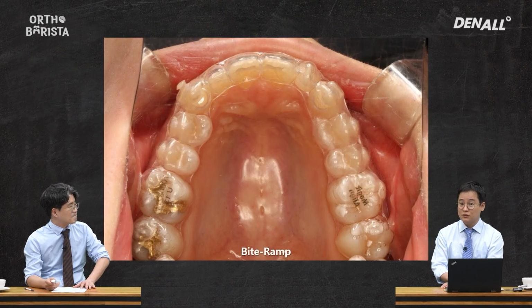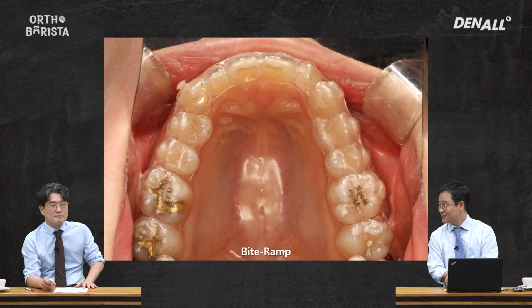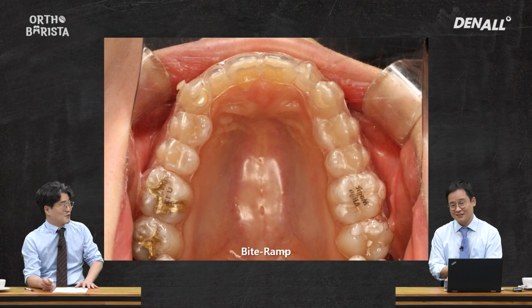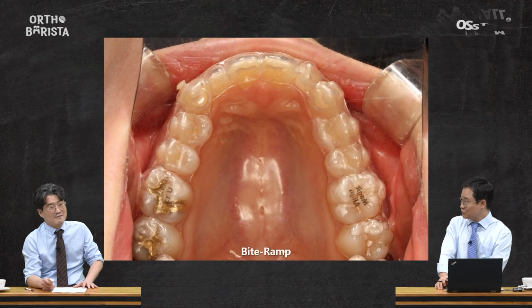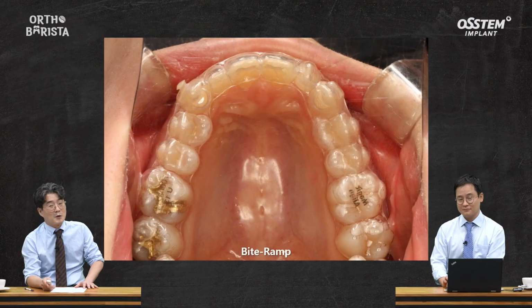With a ramp, it is definitely good. In the case of a deep bite, if the posterior region is intruded, then it may result in a bad way. Exactly. And as the clear aligners themselves are using push force, that is why this bite ramp can come in handy. Yes, I think they are really useful.